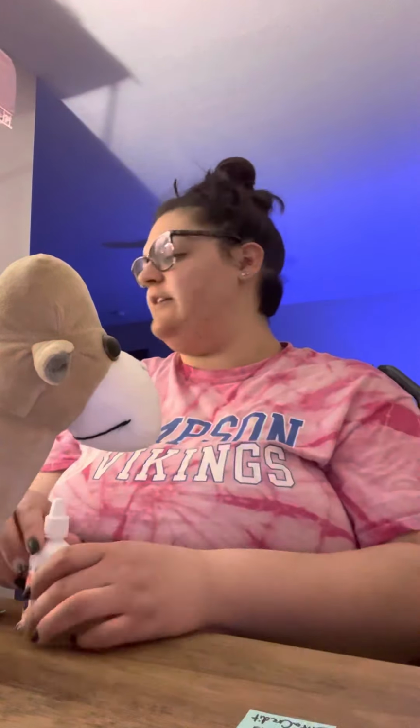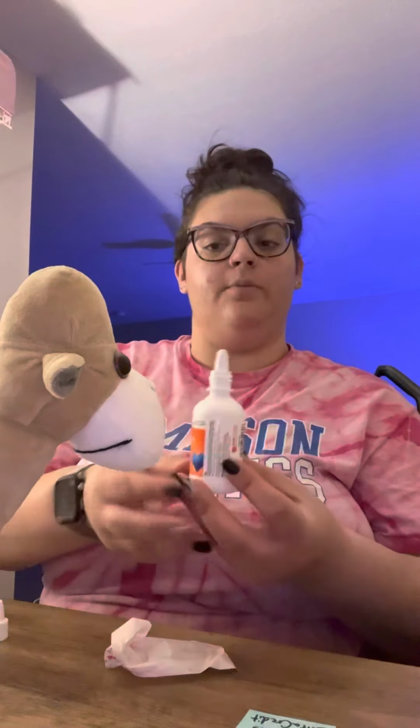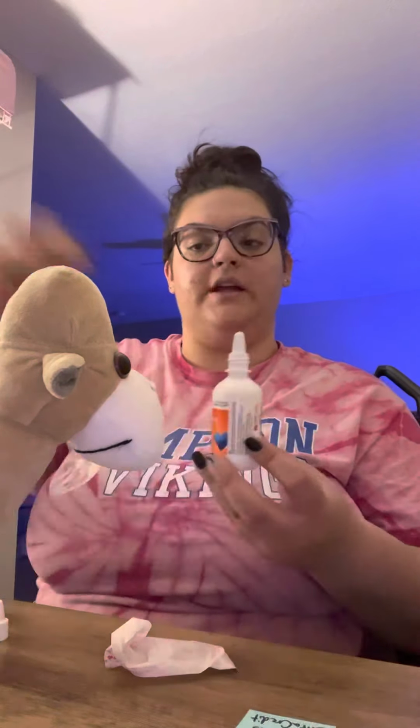And then I will have him take a deep inhale through the nostril that I'm applicating and have him block the opposite. So for instance, I'm going to start here to the side that's closest to me, which is his left side. So I'll have him block, I'll do it for him, his right side of his nose. And then at the count of 3, he will inhale while I spray it simultaneously. So we'll go 1, 2, and 3. Inhale. All right. And then have him dab there a little bit if he has any residue at the bottom.